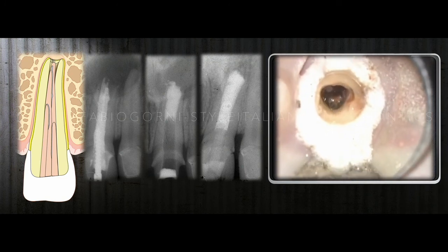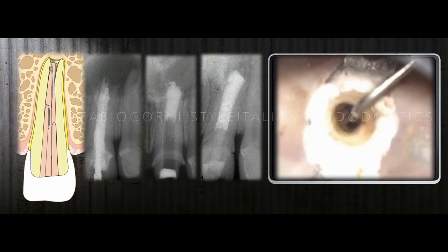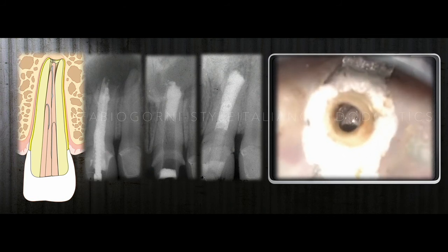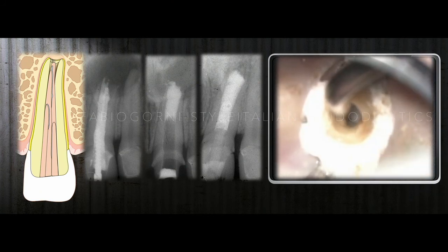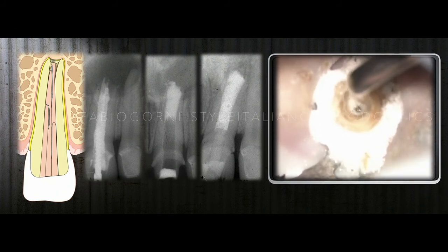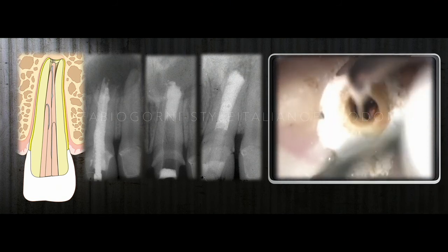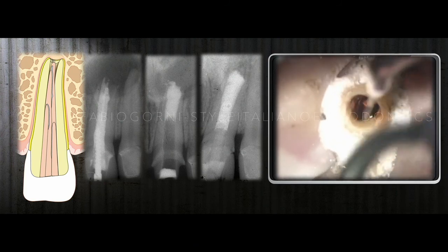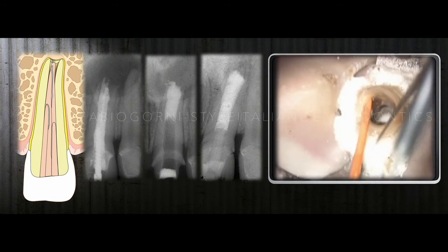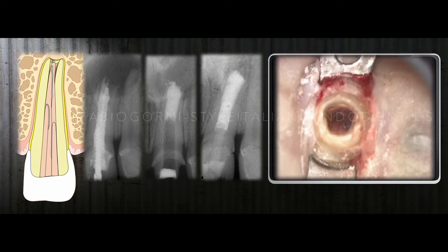It's not, so that's why we have to use the instrument again and try to catch the last gutta-percha cone. In this case, I change the ultrasonic tips, and I'm using ultrasonic K files, so I can move my action deeper inside of the canal. Okay, the last gutta-percha cone has been removed. And now we are ready for the packing.